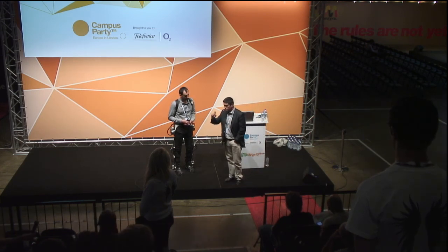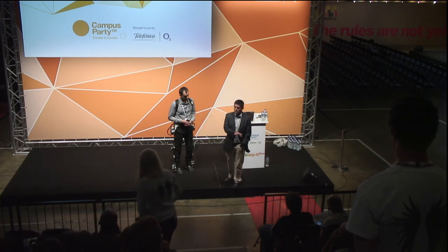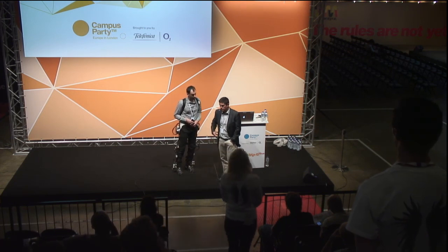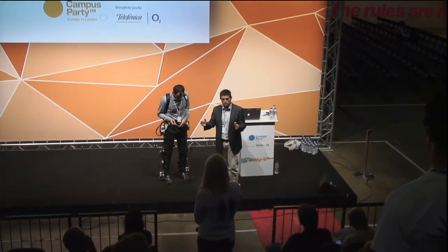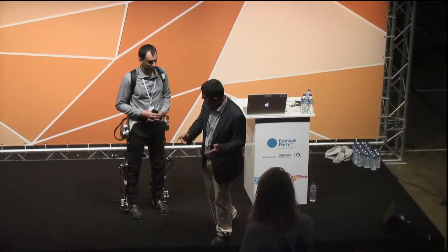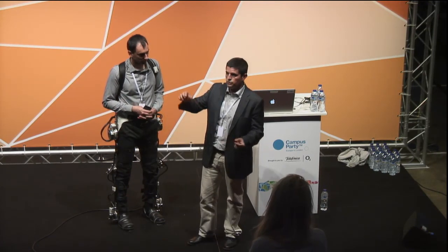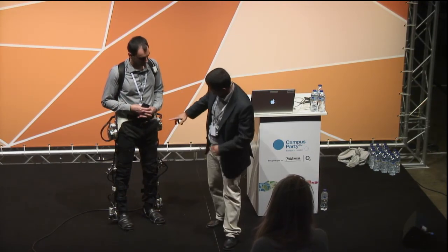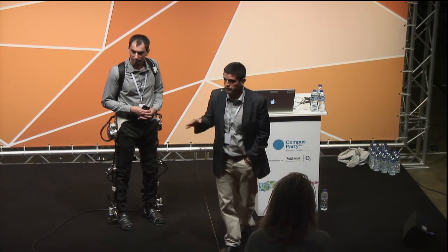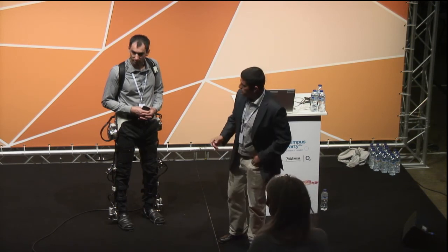I will very briefly explain how the system is set up for a particular patient. So first you take several body landmarks, and then you get some anthropometric details of the user. Then you use these bars here, which are telescopic bars, so you can adapt the length of the bars according to the size and height of the person. So you adapt the exoskeleton physically to the person.